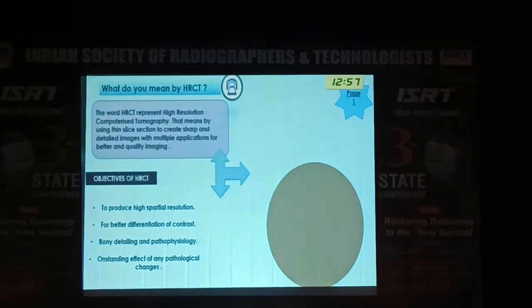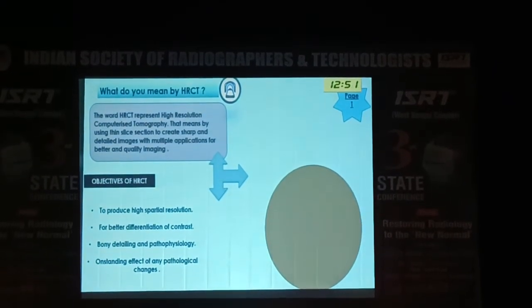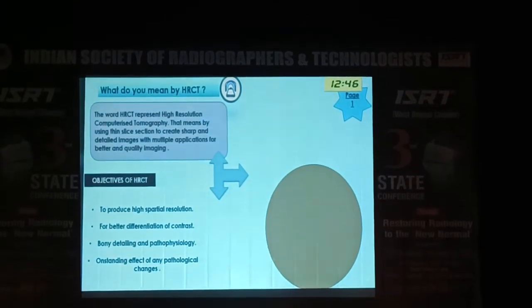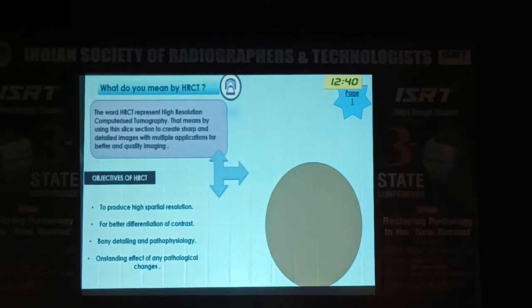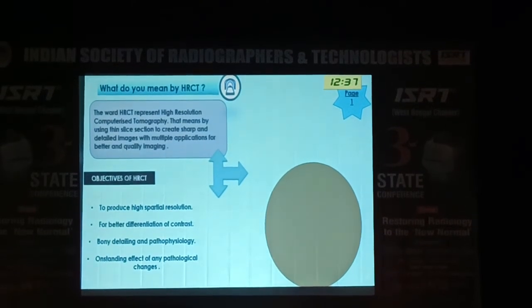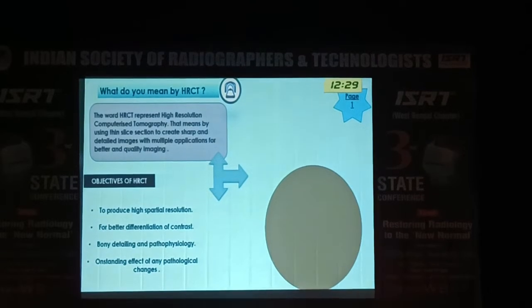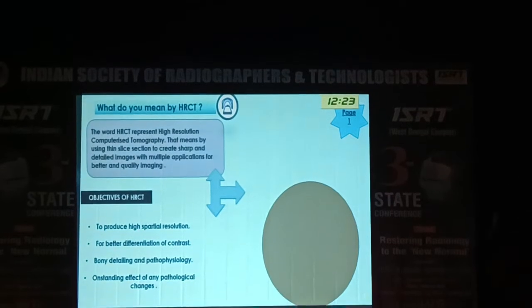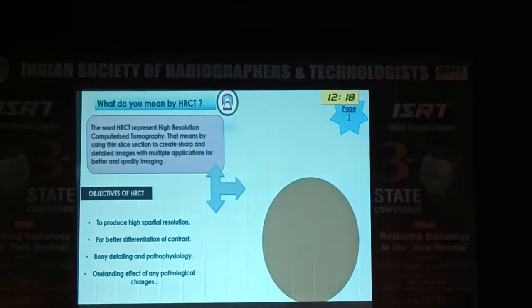If a patient comes with a history of purulent discharge or scanty discharge from the external auditory canal, it may be granulation, it may be some kind of mucosal discharge. In that case, we have to be very precise in imaging modalities. We can do MRI temporal bone also, but as far as CSOM and its indication and symptoms are concerned, we have to look for bony erosion in the affected region, the affected organ of CSOM. So CT is more preferable and takes priority. At that moment, we have to go for HRCT temporal.